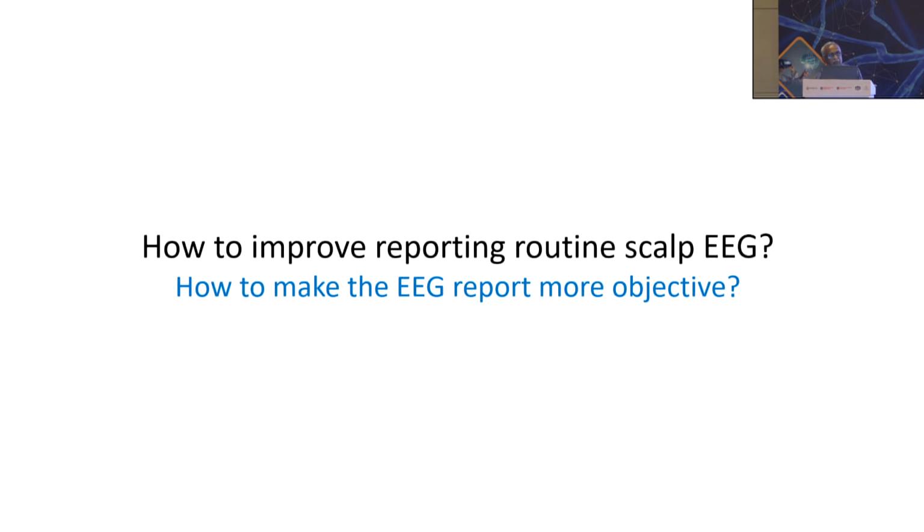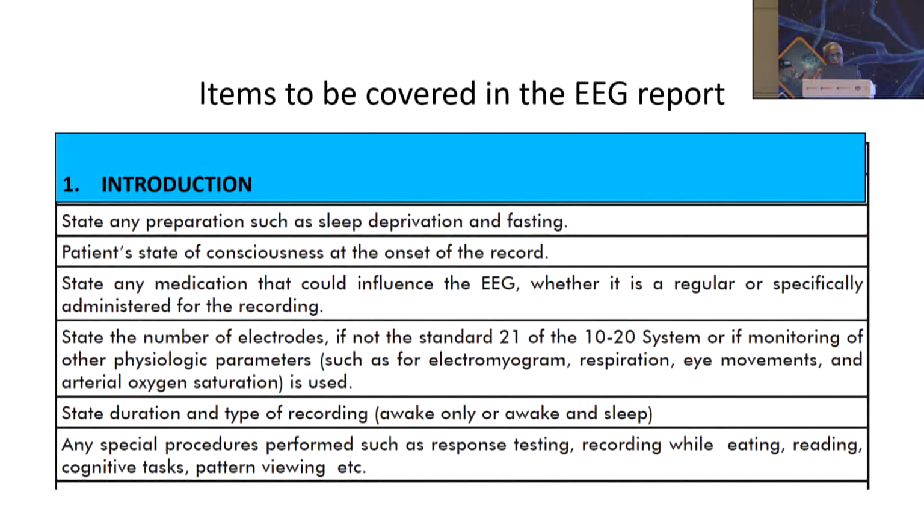So the EEG reading is largely related to your experience, and the way in which how much time you have spent in analyzing it. And so one will see how objectivity can be brought in. We have already seen how to distinguish between the benign epileptiform and the genuine epileptiform. So there are a few items which should be included in the EEG report.